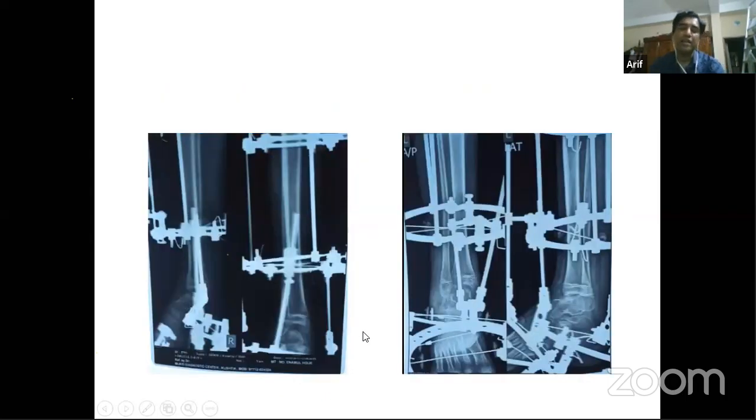this is the patient. And one interesting thing I want to mention, for the last few lectures I am interested to show you that even if you align all the hinges with good parameters, subluxation of the talus can happen. If you look minutely, there is subluxation of the talus. And what should you do? Usually my professor told me that when you put distraction in a patient, all the fingers and the tendons and ligaments are supple. They are malleable, and in a pediatric patient you can correct some range with just pressing.